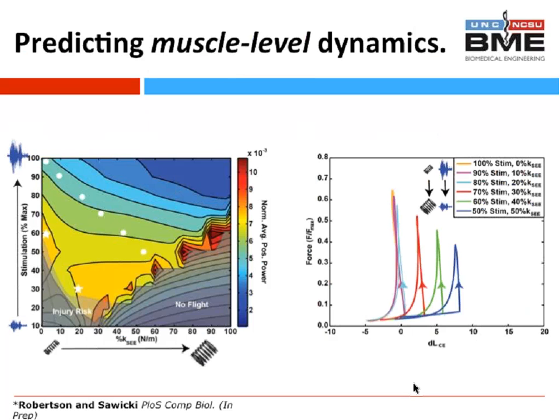All I want to point out here is that if you look at the contour graph one more time, you can see that the power produced by the muscle fascicles, which is what's plotted on the left, doesn't change very much when you trade off exoskeleton stiffness and human activation. If you follow the track of dots from top left toward bottom right, there are changes in positive power, but not large changes. This is an interesting effect, where by putting a spring in parallel with the muscle, we're not actually reducing the work demand on it, because its force is going down, but its displacement is going up.